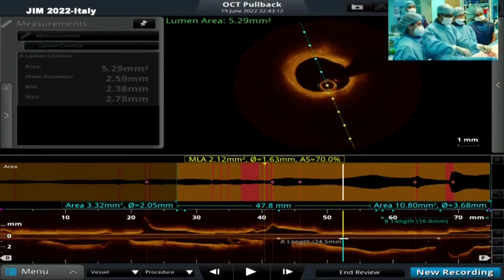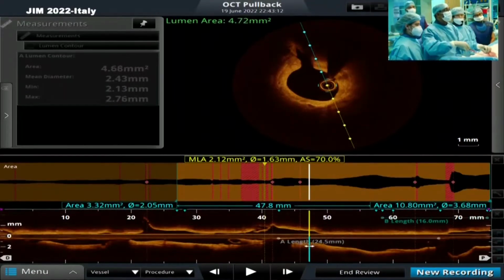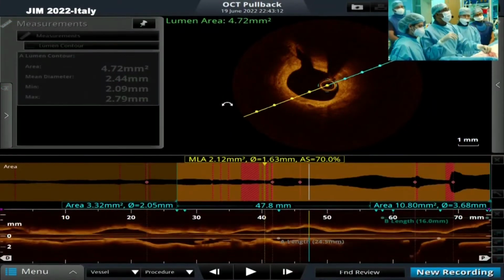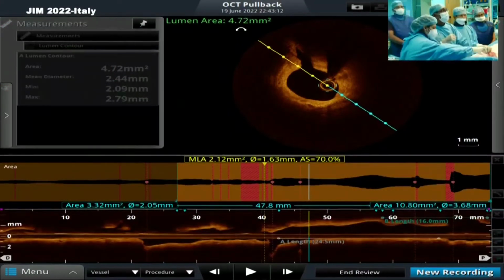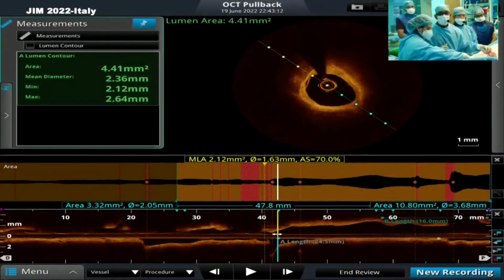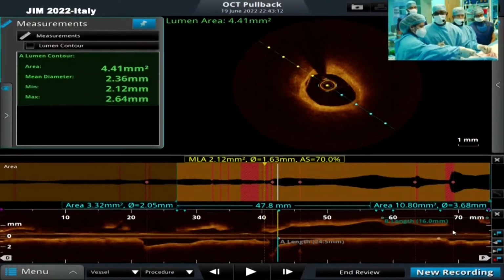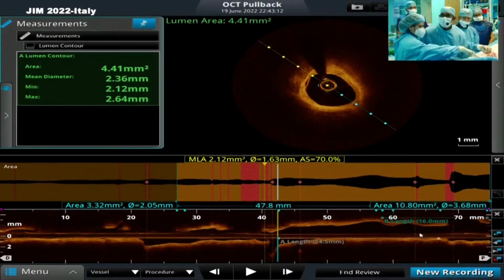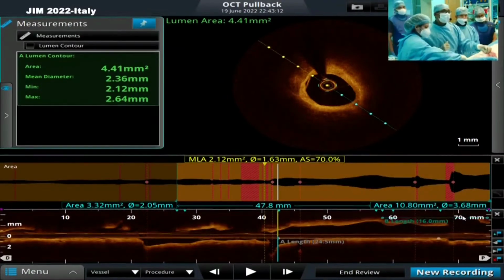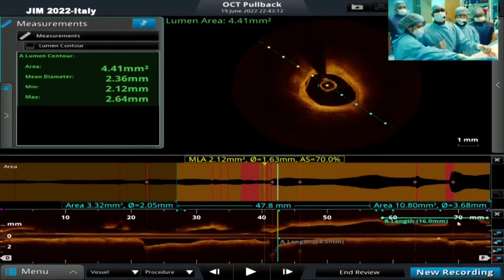And again, that's another good idea, that precision PCI is not only precision in quantity of the calcium and the lumens, but also precision in length. If we have this length, then we can calculate perhaps a 38 or a 48 stent might do the job fine, in my point of view. Then we can see where you end up.